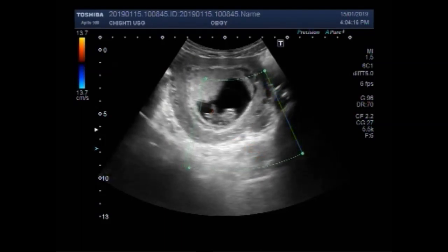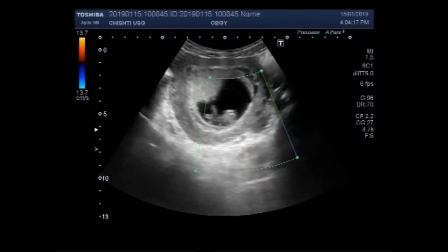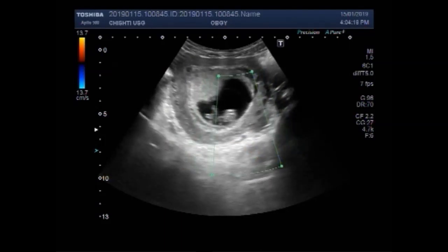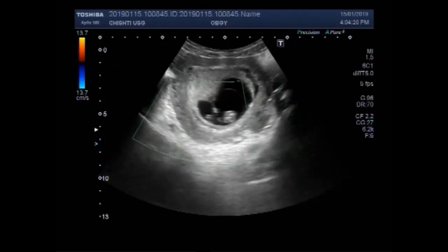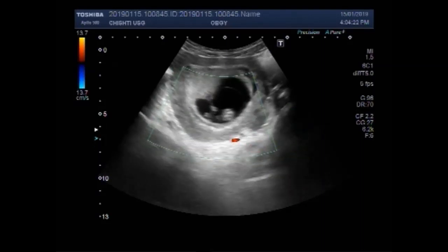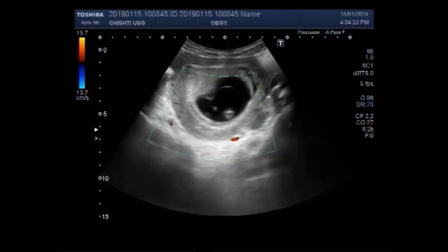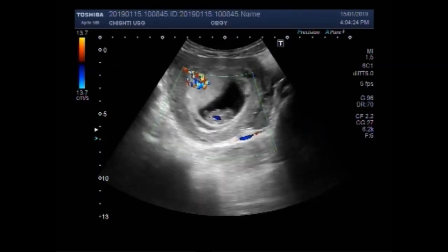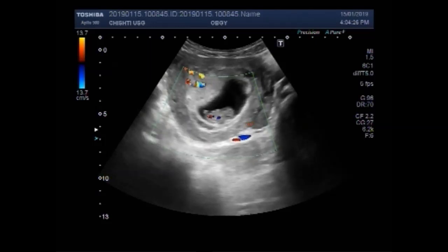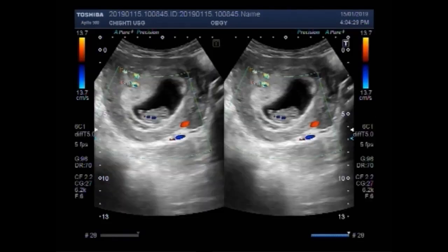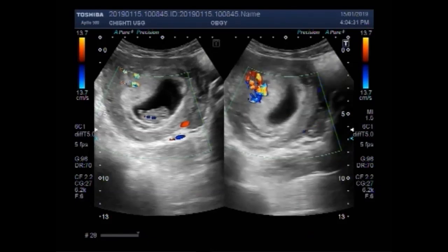Again you can see the blood flow inside the fetus. You can see the blood flow.